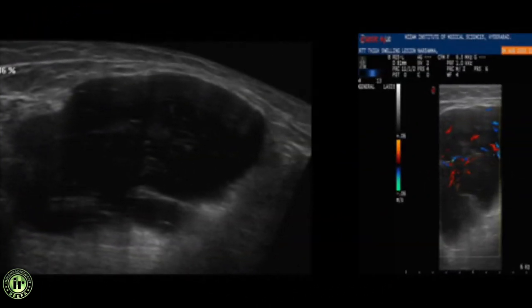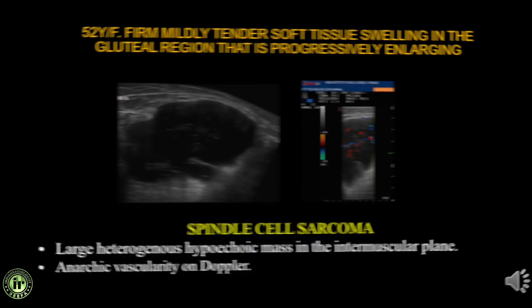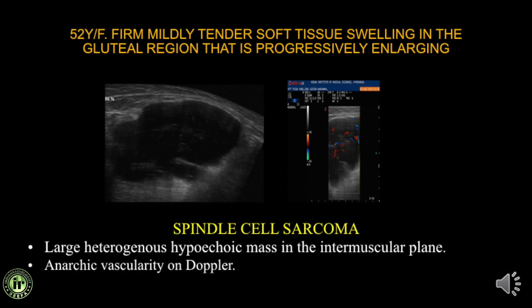A 52-year-old with a firm, mildly tender soft tissue swelling in the gluteal region that is progressively enlarging. Ultrasound shows a large heterogeneous, hypoechoic swelling in the muscular plane with very anarchic, irregular vascularity — highly suspicious. Biopsy confirmed a spindle cell sarcoma.